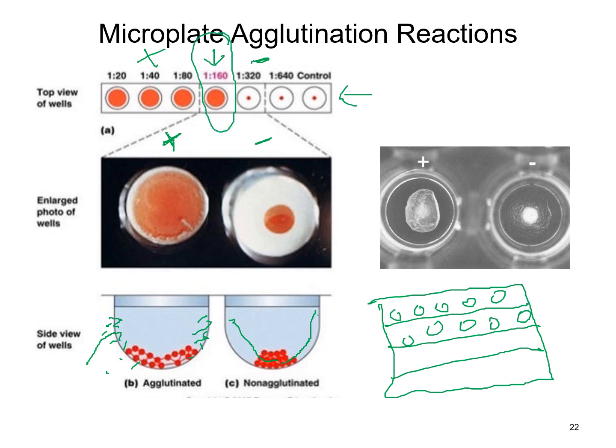So in blood bank, you're going to see a lot more of the blood cell looking agglutination. Some of your tests in micro, if it's using bacterial particles or whatever is being tested for, then you're going to see something more like this, where you're just looking for that haze of where it's attached, versus this where you've got that one little button that's been formed in the center of it.